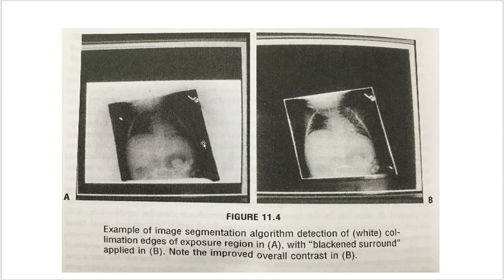So look at this lung. And this is a terrible picture. This is a picture from a book that I've put into a PowerPoint that you're now trying to see on my screen capture tool. But just appreciate the right lung. So it's just kind of black, you can't really see it.